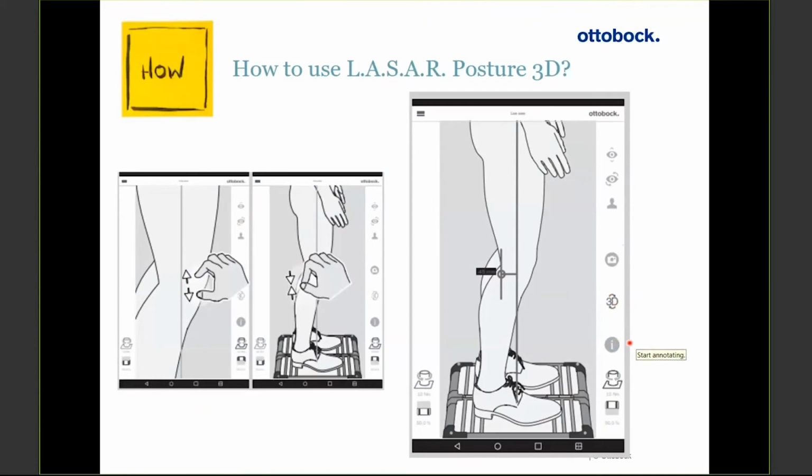So if you're not really familiar with how you would go through the alignment step by step, you can follow these short little tutorials. There's a transtibial and a transfemoral. I don't believe there is an orthotic one in there yet, my apologies. And it also has our alignment posters and also the IFU, the information for use.